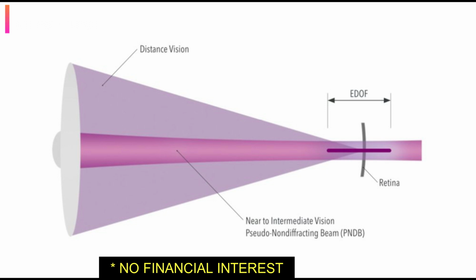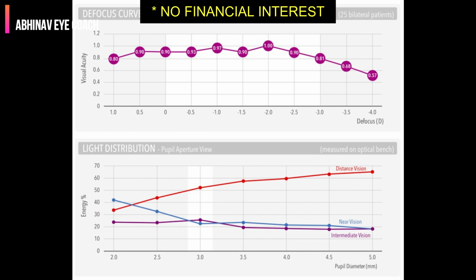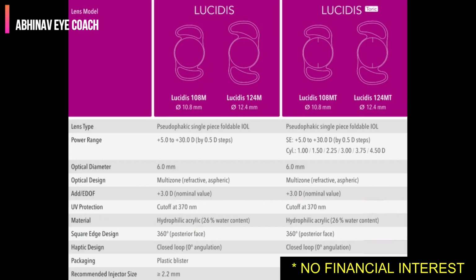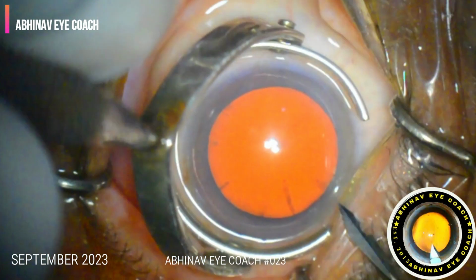And this is the optics showing that it provides extended, very good quality intermediate vision, but as it provides the intermediate vision, it compromises a little bit with the contrast also. So the defocus curve increases. It has two models, one is large and one is small for the smaller eyes.